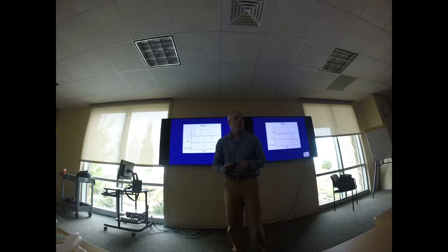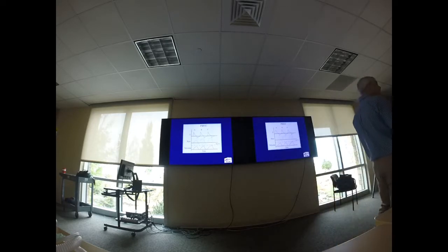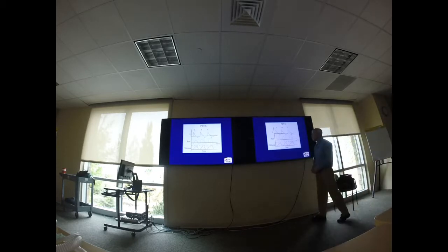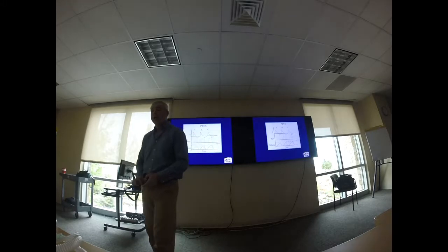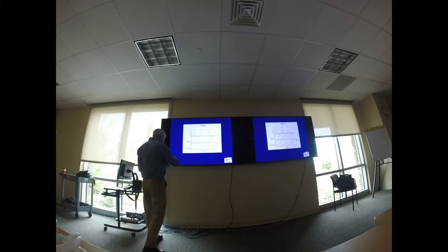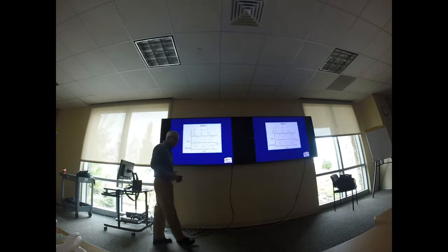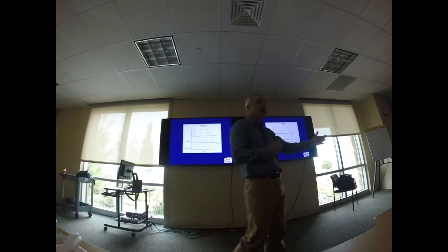But if it maxes out on a pressure, it's only going to give the volume that it can at that point. Pressure regulated volume control is a great lung protective mode of ventilation on somebody. So I've got somebody who I think might have acute respiratory distress syndrome, or they're stiff lungs for one reason or another. Pressure regulated volume control would be a good way to go ahead and ventilate that patient. Pressure regulated volume control also does it over a few breaths, so it starts to determine what the pressure is and start to give that ventilatory effort.